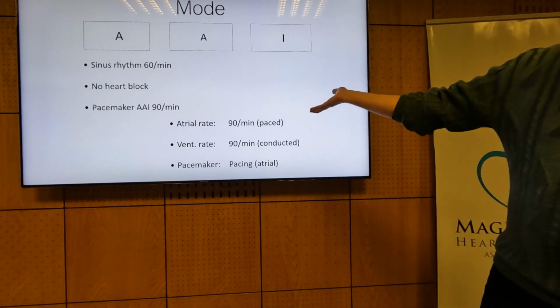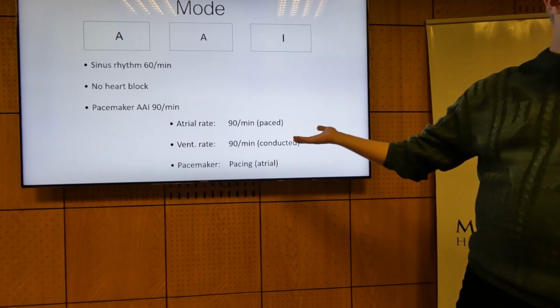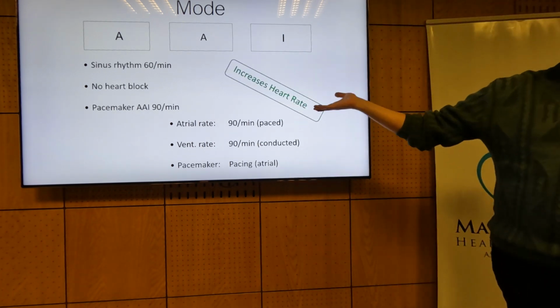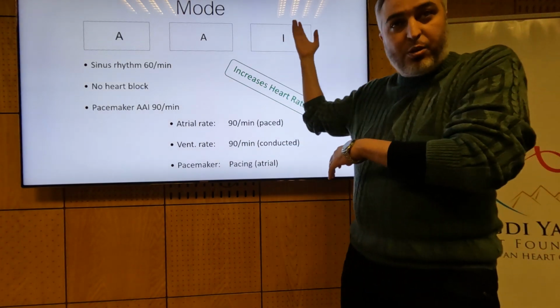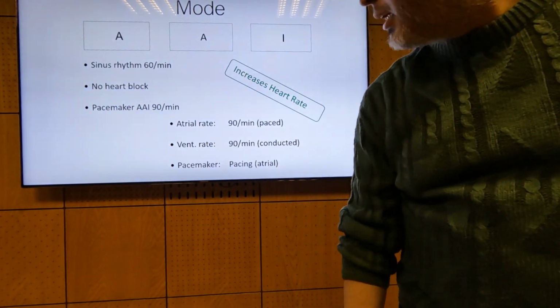So what's the benefit of this setting? What did we get from here? We were able to increase heart rate, which can be very beneficial. So now we actually got benefit from such a mode in this patient.